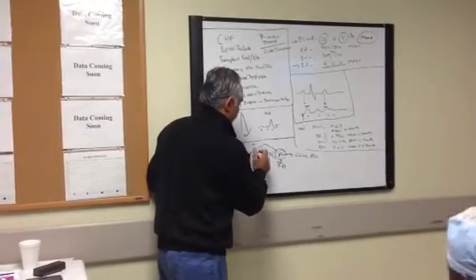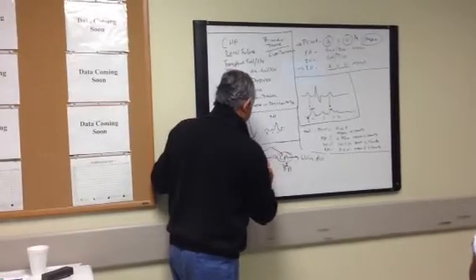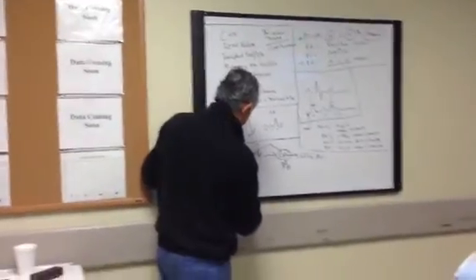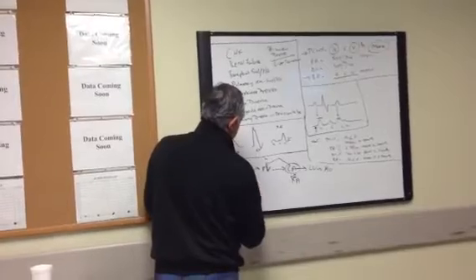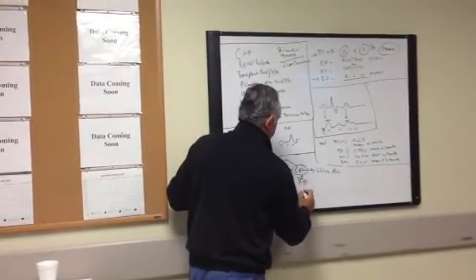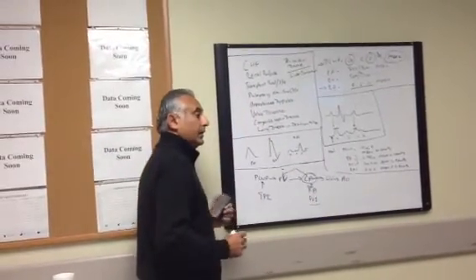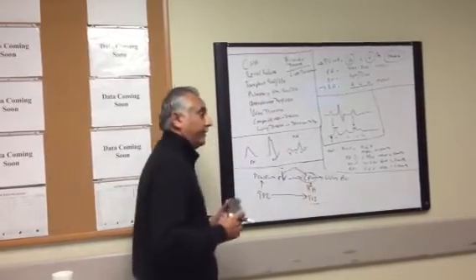Because I just told you that I'm assuming the pulmonary vein is the same as the LA. Well, but what if I have both? Let's say I have a wedge sat, and that is 98%. Okay? And I got an LA sat, and it's 88%. Well, that will tell me that there is a gradient from my pulmonary vein to my left atrium.